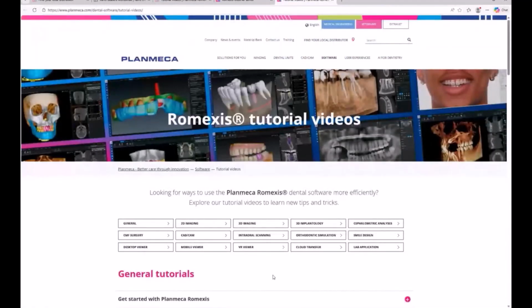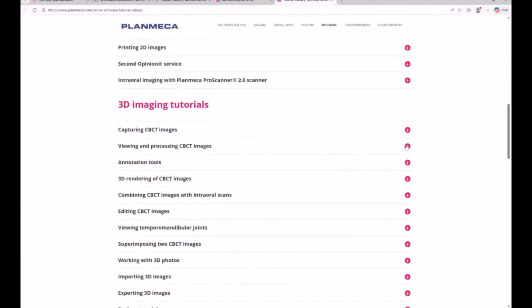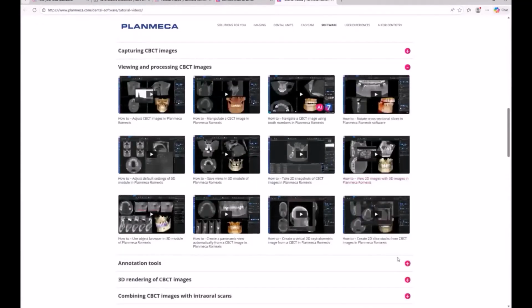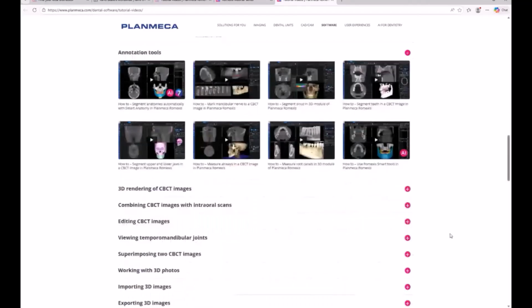You can of course also Google Romexis tutorial videos, and you will get here. We have a lot of different tutorial videos, as you can see. Most of these are maybe 1 minute long, and most of them show the usage of one specific tool. So these are very nice resources if you want to check how something is done.